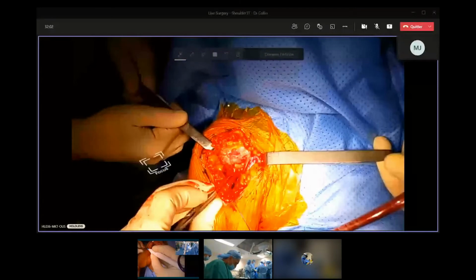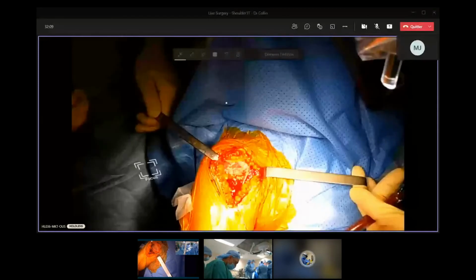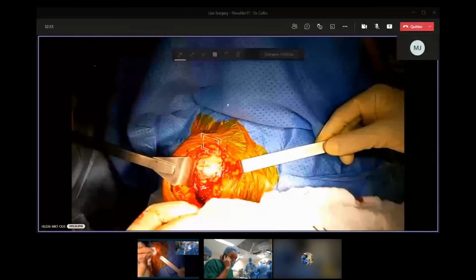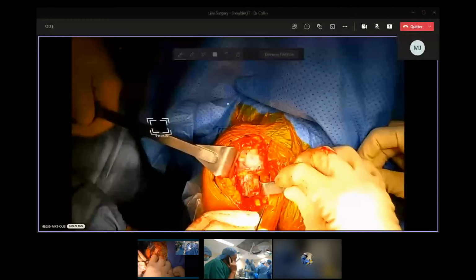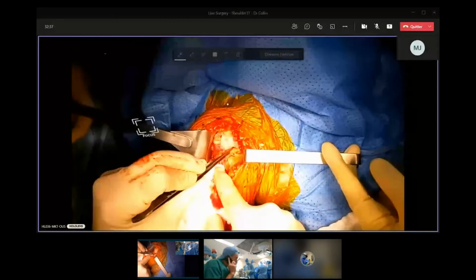Retractor, please. Okay. So you need to put this kind of retractor, which is very, very good. You put it here, like this, and then you put your arm in external rotation, and your goal is to look for the 3 sisters now. Here, you can do this, and if you put your retractor here, they are very loyal, they are very faithful. You can always find them here, look at her. There are 3 sisters here.